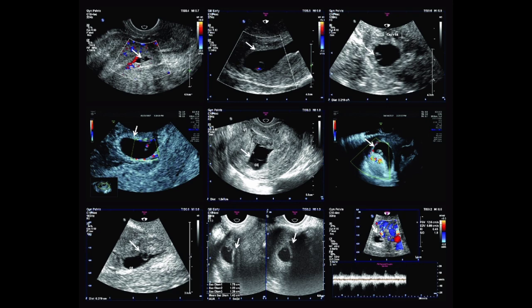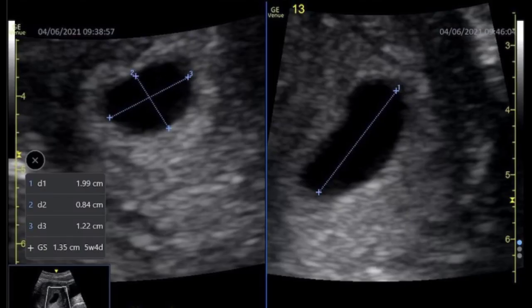The gestational sac is an echo-free space containing the fluid, embryo, and extraembryonic structures. The sac is measured inside the hyperechoic rim, including only the echo-free space. The gestational sac is imaged first in the longitudinal plane, obtaining long axis and anteroposterior measurements perpendicular to each other.